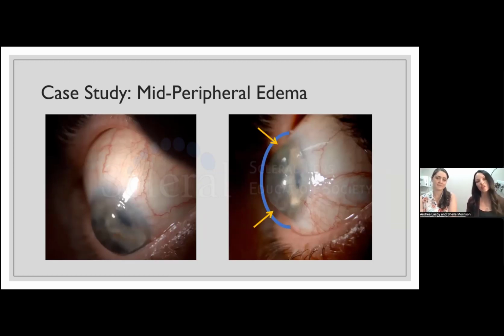And the blue image that you see is a standard contact lens shape that's fairly symmetrical all the way around. And with a lot of designs, there can be limitations. There's a lot that we can do with quad-specific toric haptics. It's really amazing in that limbal zone that in a lot of cases, we can reduce a lot of that excess of space. This patient had lenses that were to the max ability of decrease in the limbal zone in a particular lens design.